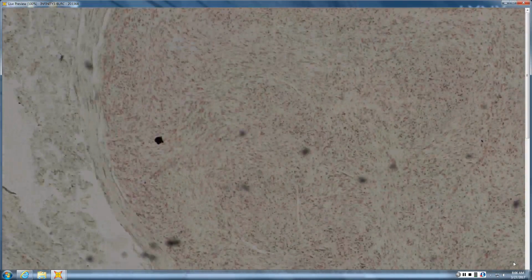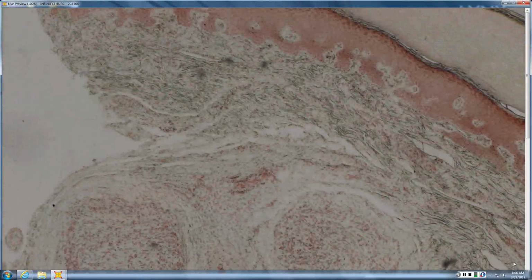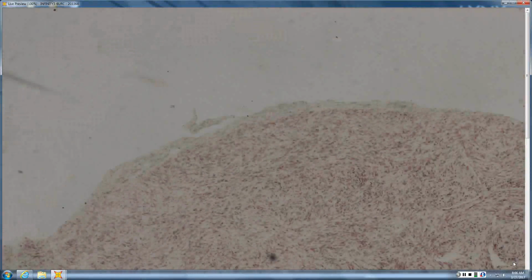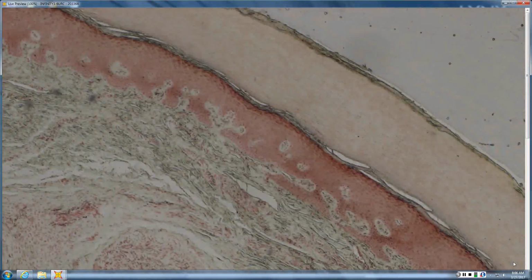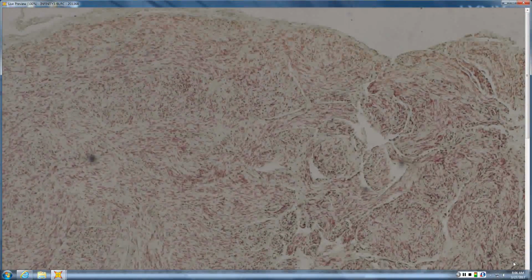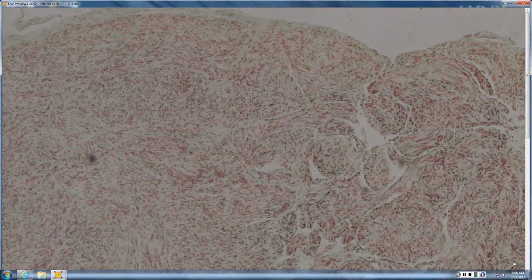So this looks like balls of nerve fascicles. Is it a single vertically oriented superficial thing like a PEN? No, they're more individual fascicles and multiple fascicles. So I'd be thinking more like neuroma. Like a neuroma, and neuromas are most commonly where on the body? Acral. Acral, and it looks like acral skin. And it's usually a true traumatic neuroma. It's broken into fascicles like a PEN, but instead of being superficial, vertically oriented, small, it's a big, deep tumor.